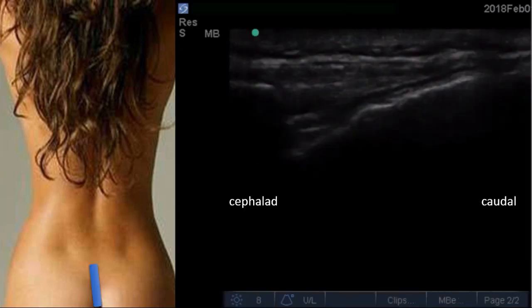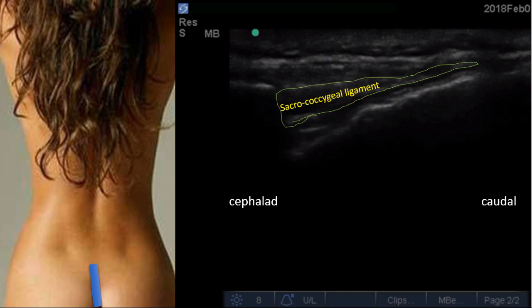When we turn the probe longitudinally at this level, we find the sacrococcygeal ligament, the base of the sacrum below, the dorsal and ventral surfaces, and the sacrococcygeal ligament over here. The needle will come from this area to reach the epidural space, with the dorsal base of the sacrum visible below.